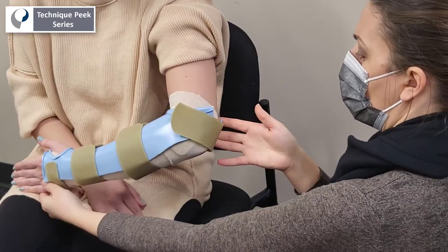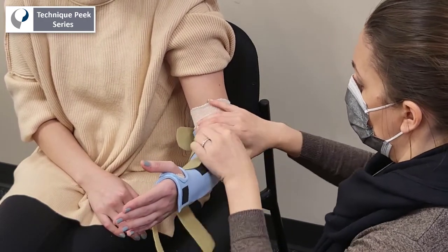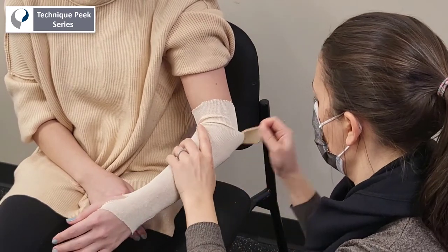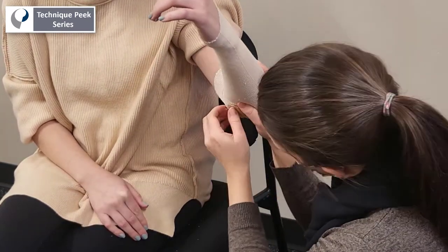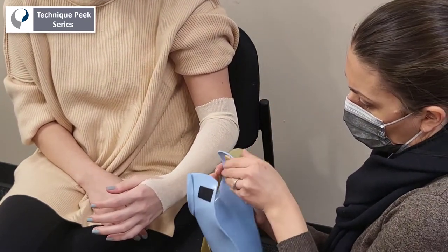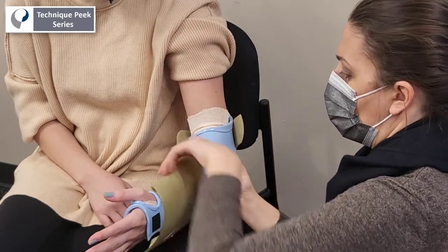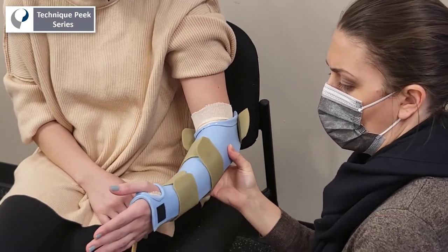Once you check for fit, you can repurpose the padding used in the initial fabrication from the epicondyles and place it inside the medial and lateral aspects of the splint for further alleviation of pressure points. Now you can replace the splint, check for fit and comfort, and secure your straps. I hope you found this video helpful and thanks for tuning in.